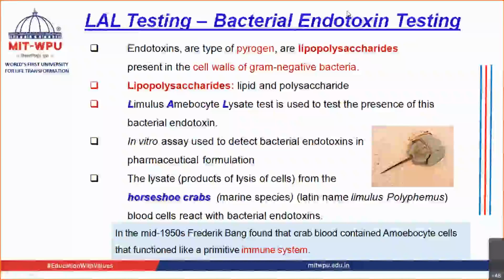Next test that we are going to see today is the LAL test, also known as Bacterial Endotoxin Testing. Before going deep into this test, let us first understand a few terminologies and something about this test. Then we will see how we perform this test.